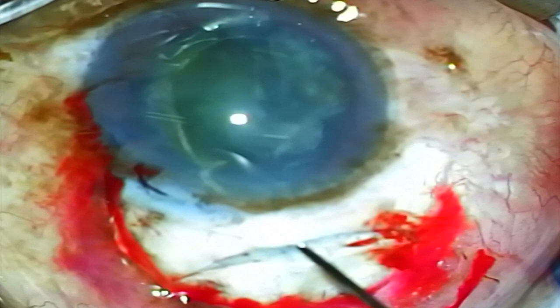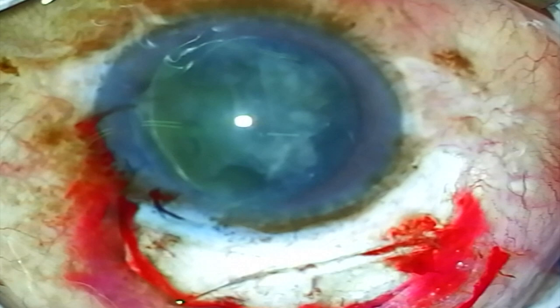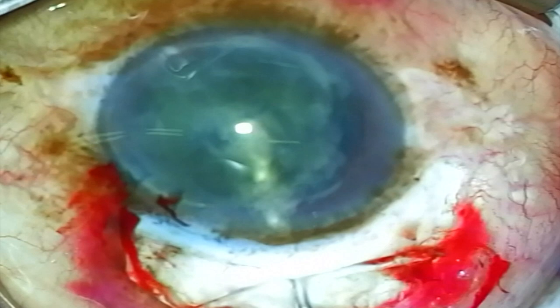But as I am persistent here and try rotating in the other direction, eventually an edge comes up and I'm able to grasp that with the Chang cannula. I then get underneath the lens with some BSS and prolapse the lens into the anterior chamber.